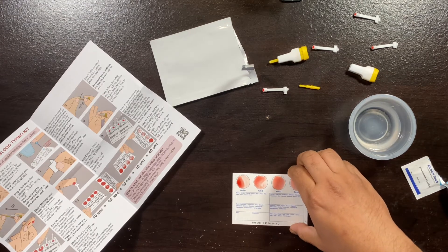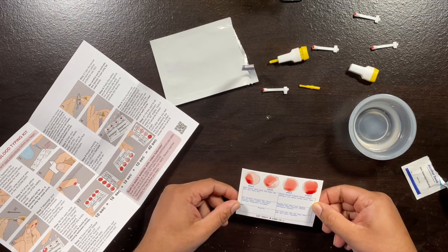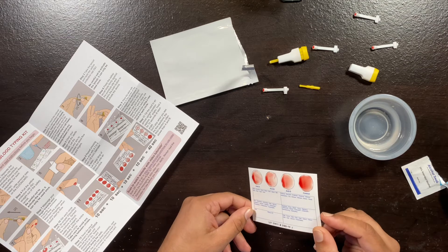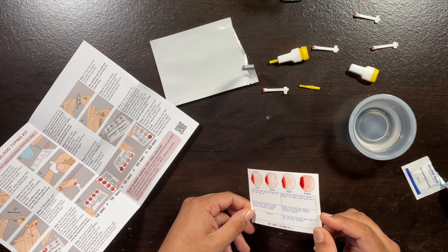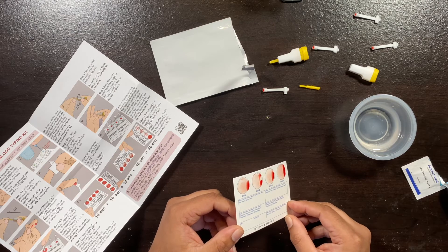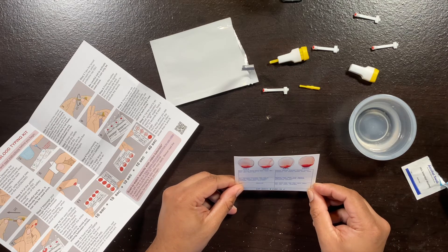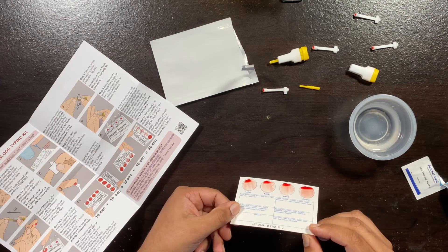Now you have to tilt the card at about a 45-degree angle. Hold it at each angle for 10 seconds. I'm going to keep it on the left side angle for 10 seconds, then the other side for 10 seconds, then this way for 10 seconds, and this way. We should start seeing a reaction by now.